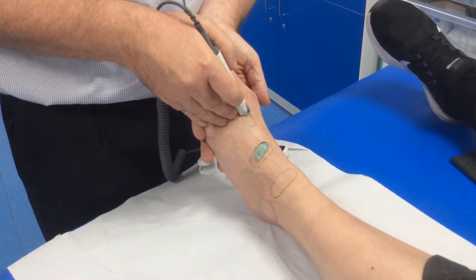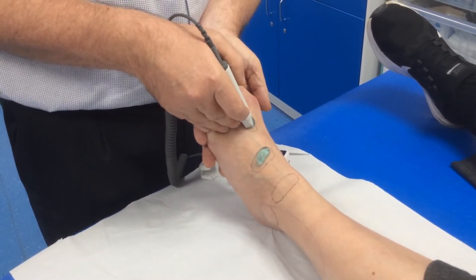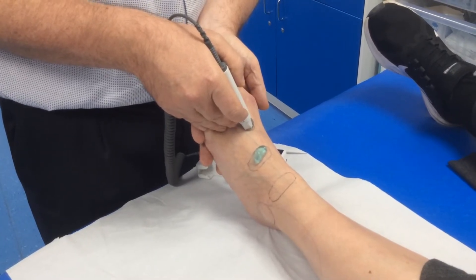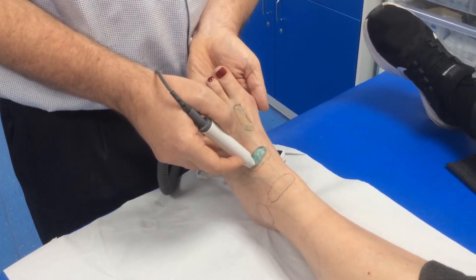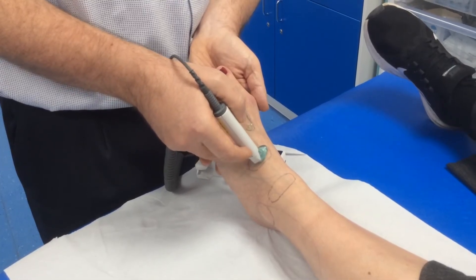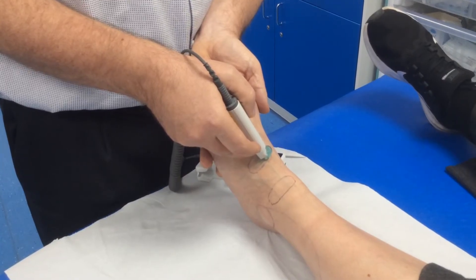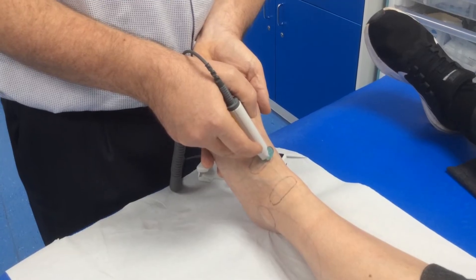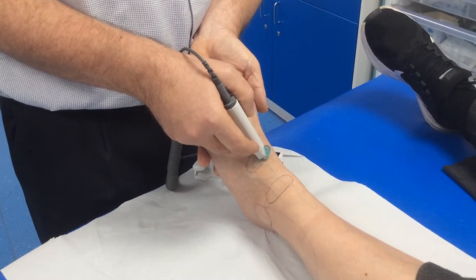Sliding up the crease if necessary to locate the best signal. If I couldn't locate the pulse there, I would be searching across the middle of the foot looking for the pulse at that site. Again sliding slowly in the gel, not too much pressure on the skin. I'd usually be anchored to the foot with my other fingers, with the probe at an angle of about 45 to 60 degrees.